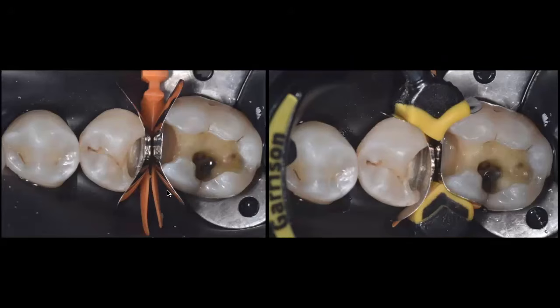The most important thing is that the openness of the wedge, the split tip of the wedge, always goes to the lingual, and you will also place a ring. There's a right-sided and a left-sided ring, and you know this because of the little arrow tinted with black marker on the lingual side. This is the portion of the ring that goes in between and needs to split the wedge, half of the wedge to the buccal and half to the lingual, so that it recontours the band.